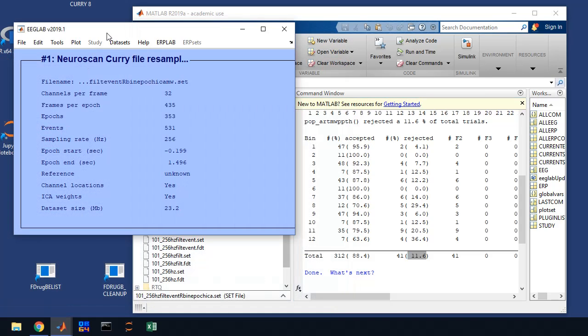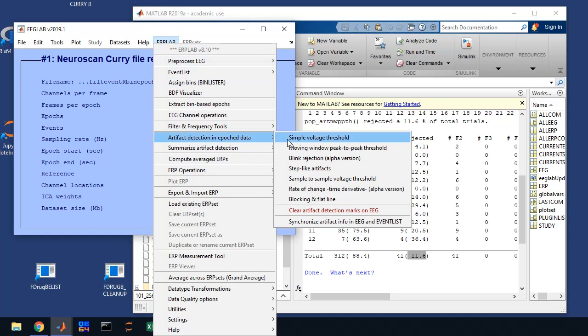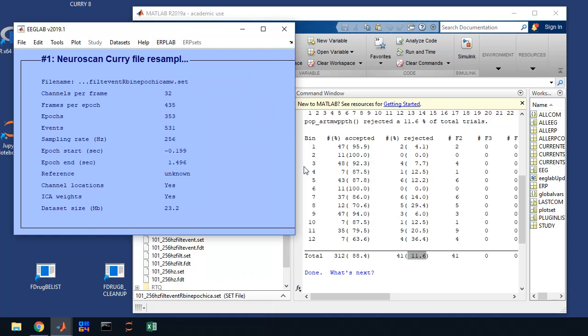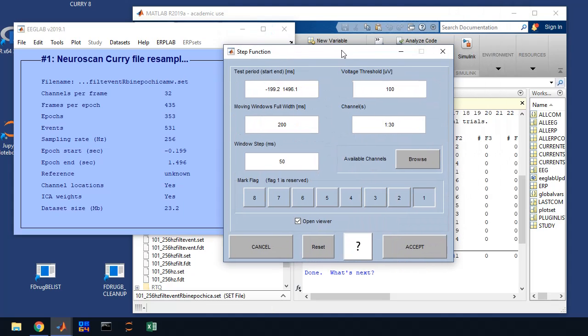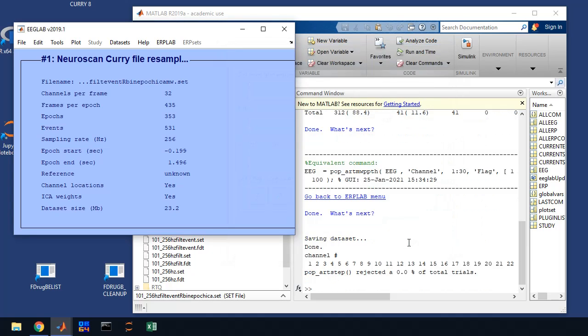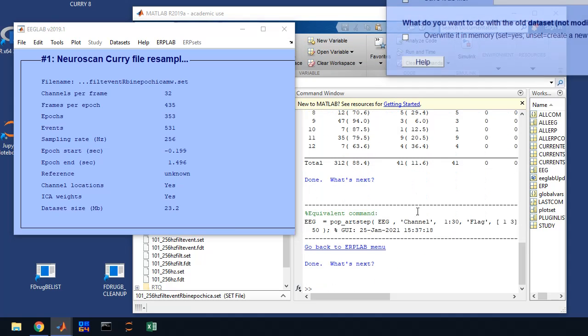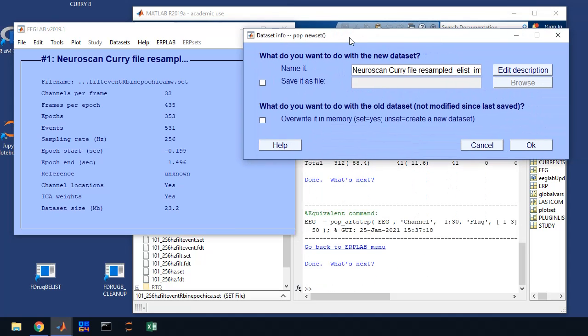And we can move on and do our next artifact rejection, which is step-like artifacts. Again, you're going to pay attention to the check the values in the window. They should be fine. Click three for this one. We'll get rid of the viewer this time. And we'll click accept. And here's what's going to happen. We're going to get our table in our command window. We have to save our data.